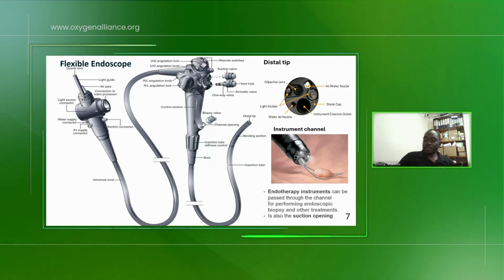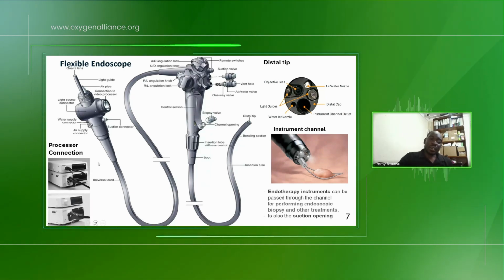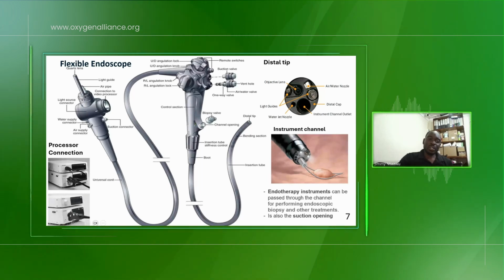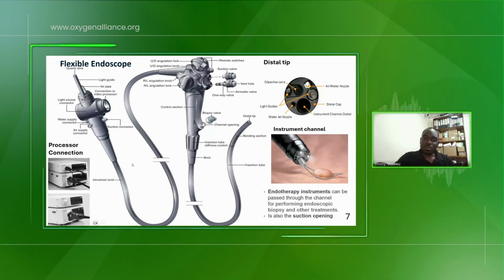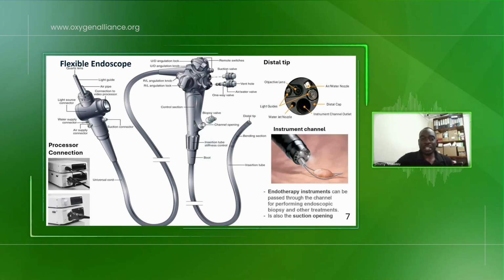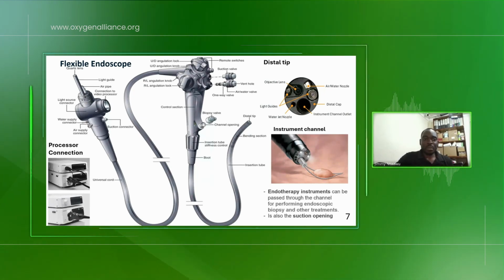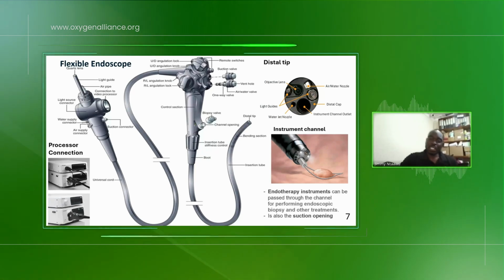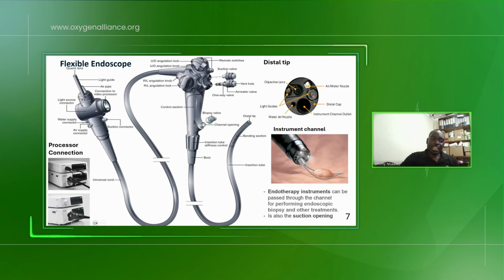Yeah, so the connection side, we have different connections depending on the technologies. Maybe something to note, I'm going to use majorly examples of Fujifilm because at Medic Uganda Limited, we have a contract with Fuji and we majorly deal in endoscopes of Fuji. Yes, so we have different connectors.